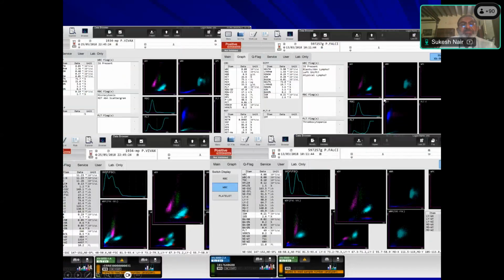Same patient, you can see that the neutrophils are exaggerated because many of the infected red cells don't lyse and they get counted as neutrophils. And you can see that in the other population, these are infected red cells which are counted mistakenly as neutrophils. So pseudoneutrophilia can indicate malaria in some cell counters. And sometimes you can see that an extra population of eosinophils can also be identified.